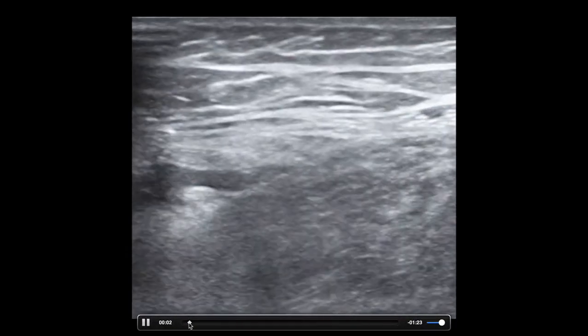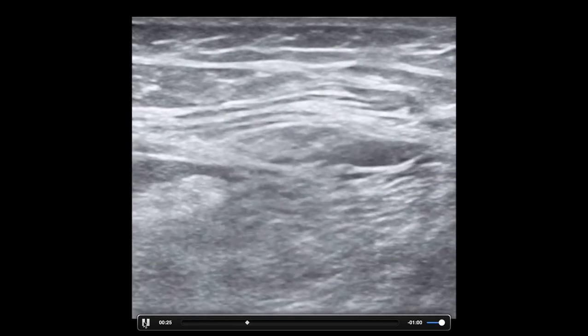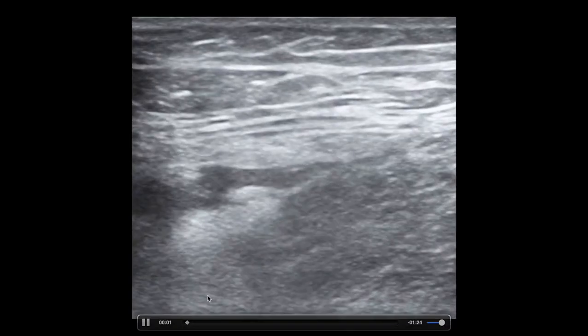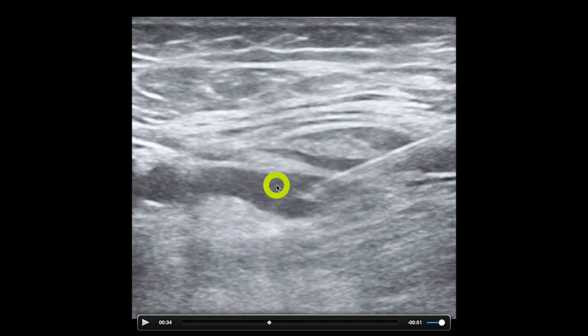You can see my needle coming in on the left side, and I'm injecting right above what I think is the fascia iliaca. I'm getting good spread, but notice this line right here — this is actually the fascia iliaca, and I'm above it with muscle up here. So I want to advance the needle just a little bit further to get underneath it. You can see me redirecting it going underneath, and now I'm getting nice spread underneath the fascia iliaca, which is my goal — not necessarily getting to the femoral nerve itself, but getting underneath the fascia iliaca.